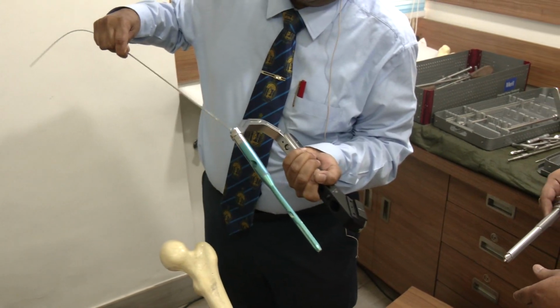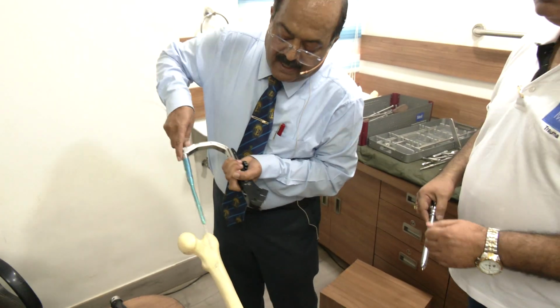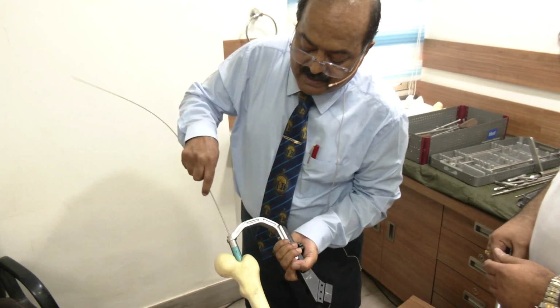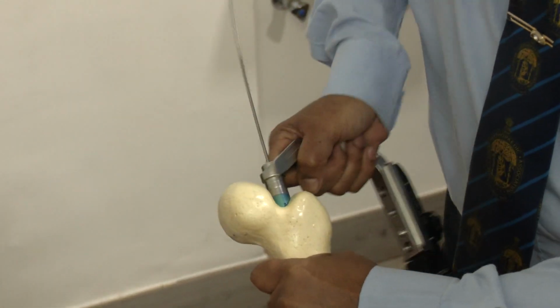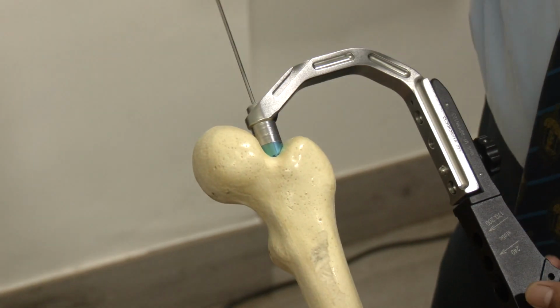Okay. This beaded guide wire can come out of the nail. So that's another advantage with the system. You need not exchange the jig guide wire for reaming and passing the nail. So I pass the nail approximately.